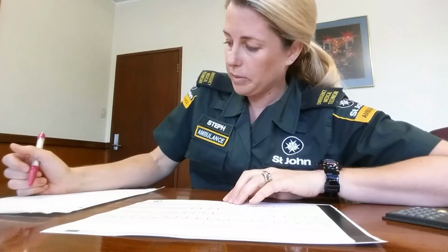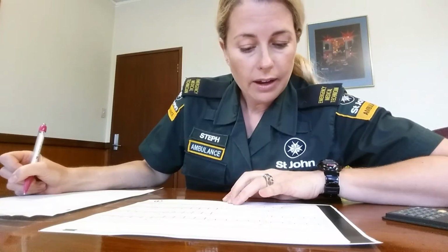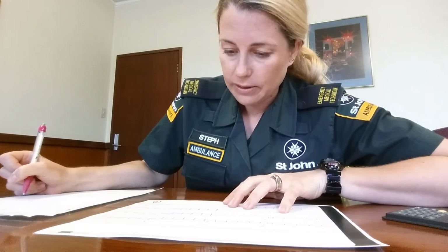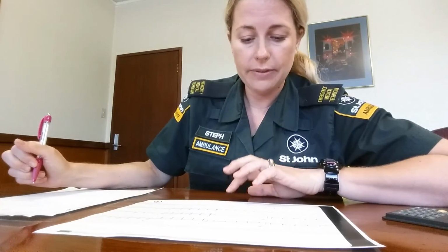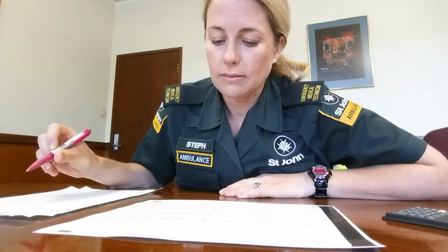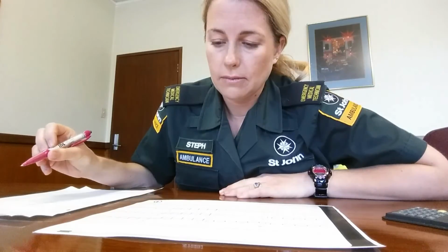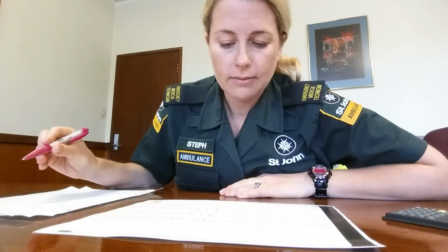So interpretation will be sinus tachycardia is the underlying rhythm. We've got an intra-atrial conduction delay. Looks to be an inferior posterior STEMI with lateral extension. I'd like to get a V4R and a posterior ECG to confirm. So your posterior ECG, you see 2 millimeters of ST elevation in V7 through to V9. So I'd say yeah. And for V4R, you see 2 millimeters of ST segment elevation.